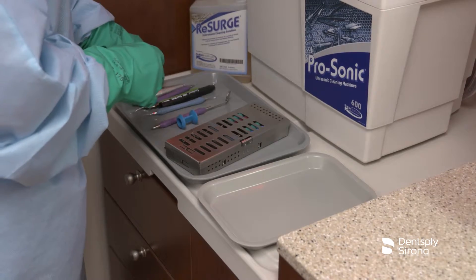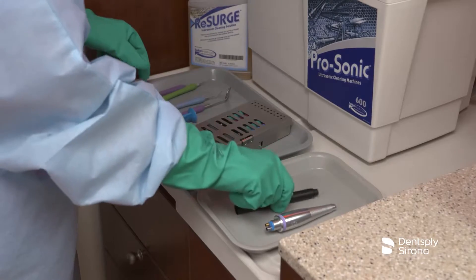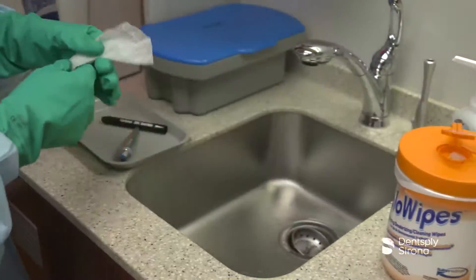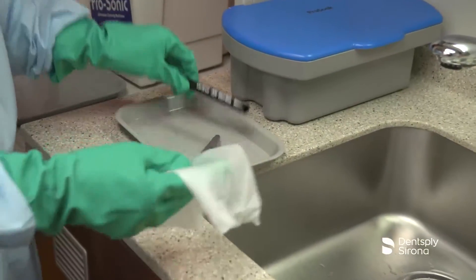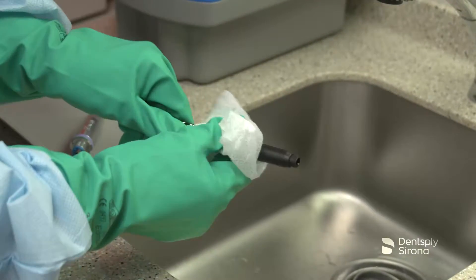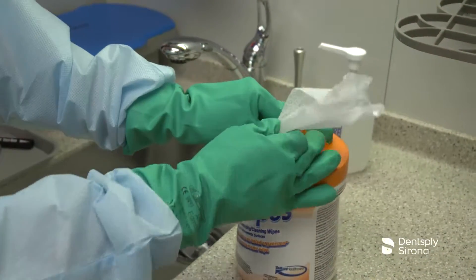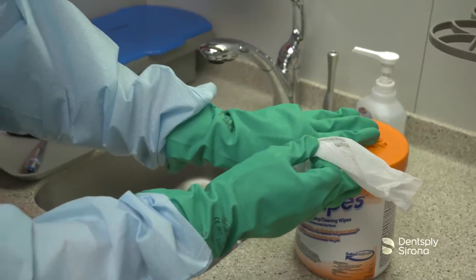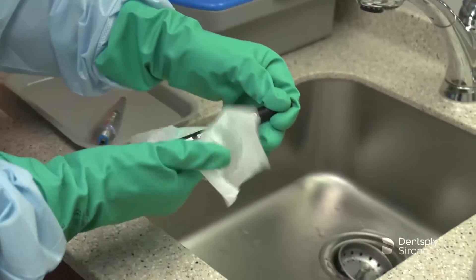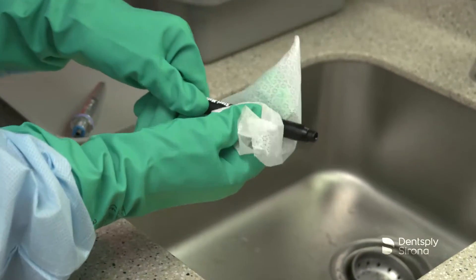Once handpieces have been separated from instruments for reprocessing and the manufacturer's guidelines have been reviewed, reprocessing should begin to prevent any residue or contamination from drying on the device. Begin by removing any moist debris or residue on the SteriMate handpiece by using a disposable disinfectant cleaning wipe like Volo wipes. Rinse the SteriMate handpiece under running water. After cleaning the SteriMate handpiece thoroughly, disinfect all surfaces by wiping with a disposable wipe in combination with a bactericidal, biocidal, and fungicidal instrument disinfection solution, observing the concentration rates and contact times.